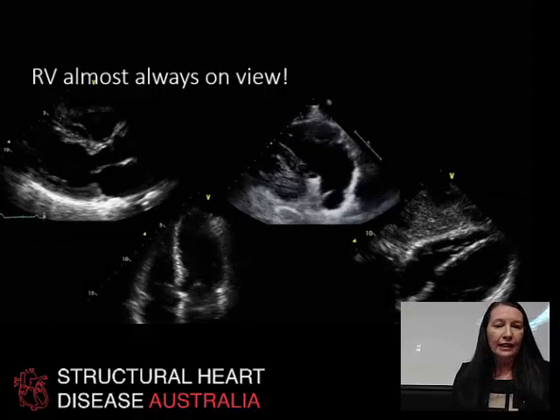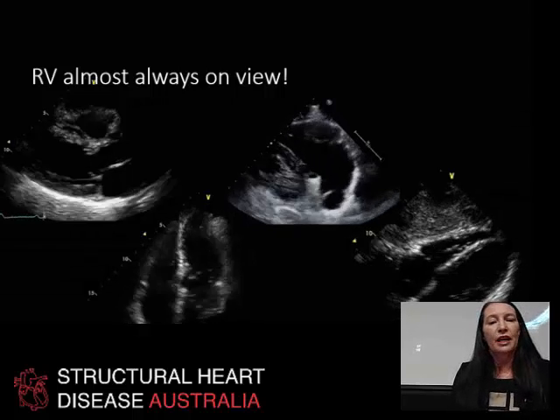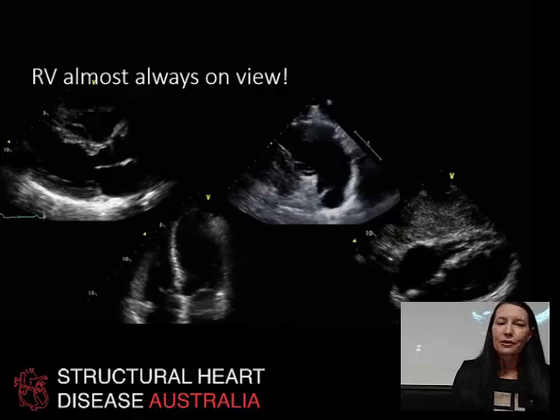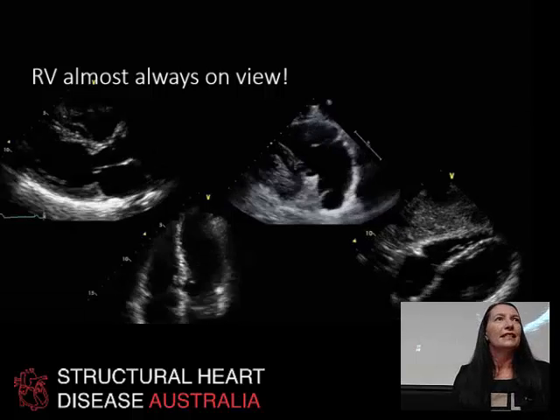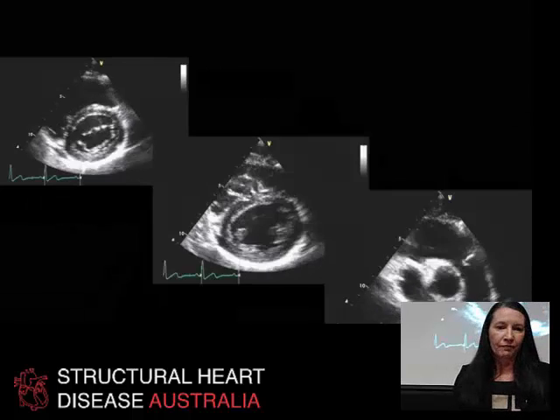The parasternal long axis, the four chambers, the subcostal, and even the inflow view where you can still see a little bit of the left ventricle. The right ventricle is always on view. And so there's something there to be had and to be measured.